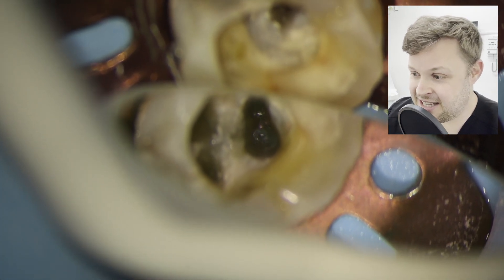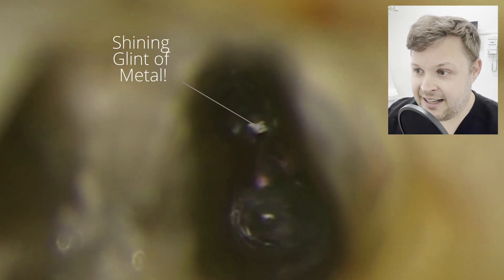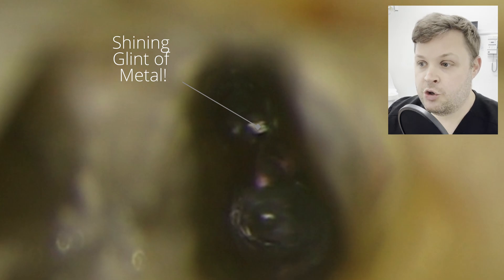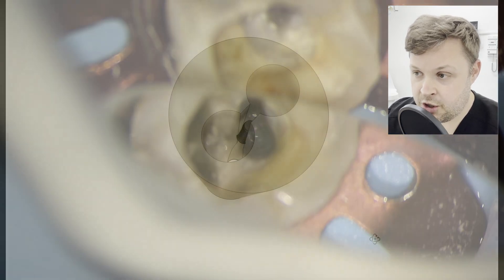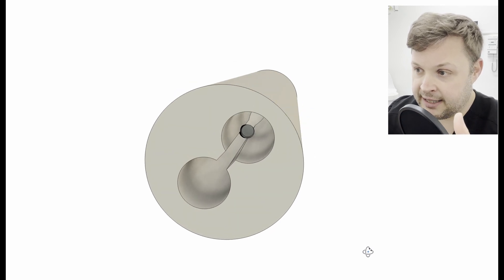Using a microscope is really, really useful in this case. Luckily I can see a little square glint of metal. So we've confirmed the file has fractured and I can visualize it straight away — that's the first great thing.